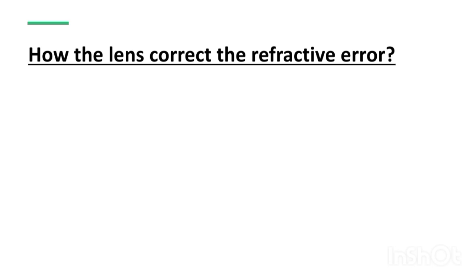So what we are actually doing is shifting the focal point of the rays of light from the anterior portion onto the retina. How do we do this? We put the minus lens. This minus lens changes the divergence of the parallel light rays. In myopic eyes, every refractive component is steeper or more curved, so the refractive power of the myopic eye is more than normal.